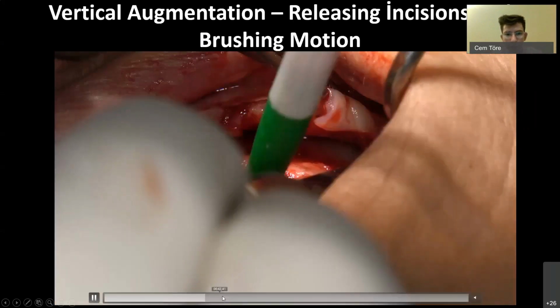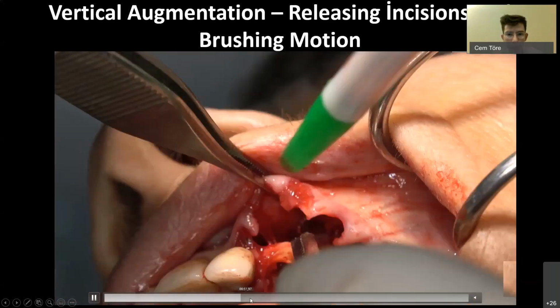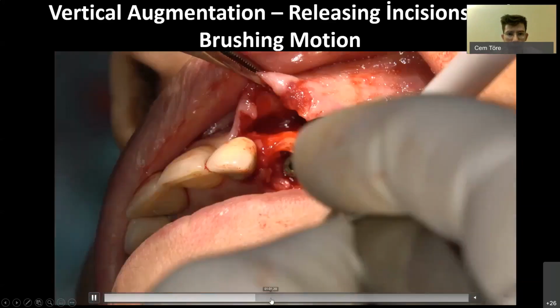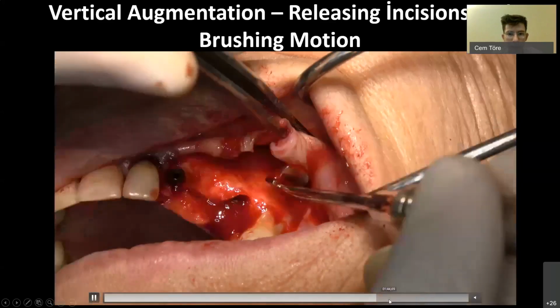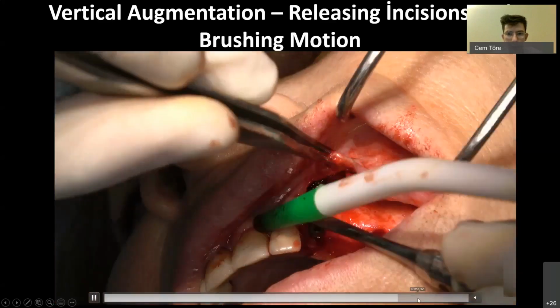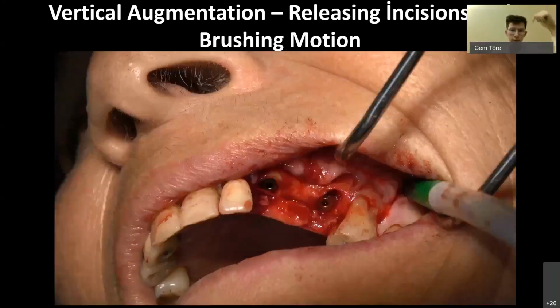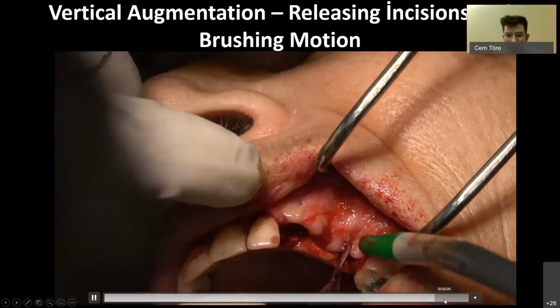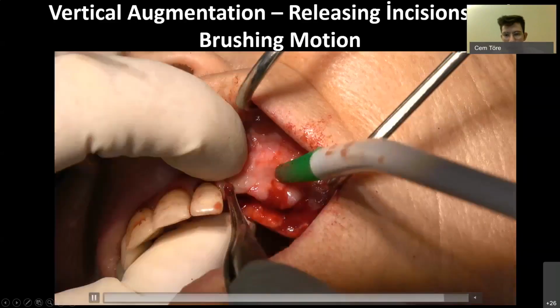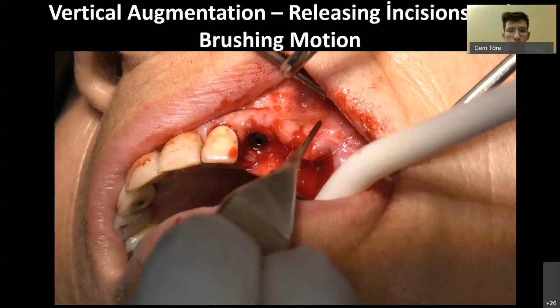We make an incision on the base of the flap, all the way, the whole flap. A superficial one at first, and then brushing. And for the areas that don't want to relax, around 2, with a blade, just those strings need to be incised, and then we can close it easily. We check along the way, do we have enough? No, a little more. Checking up, do we have enough? No, a little more, until we have enough flap to easily close the area tension-free.